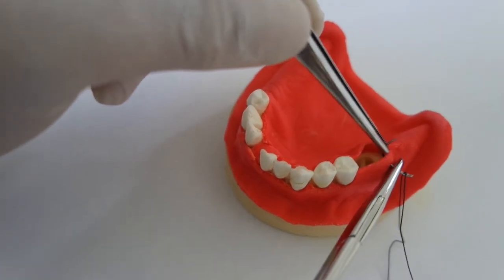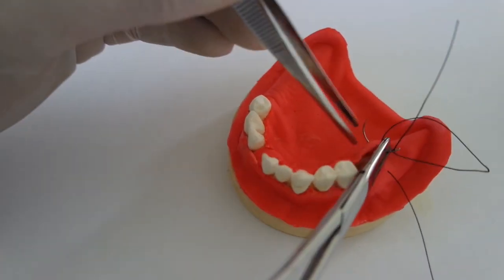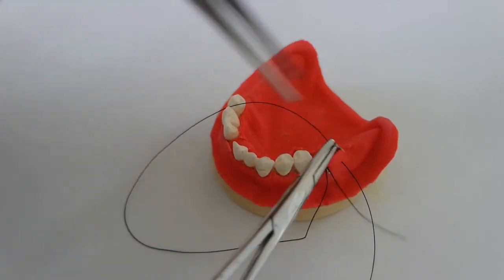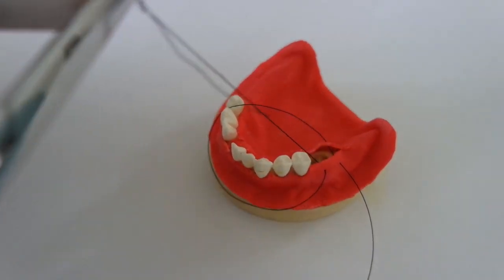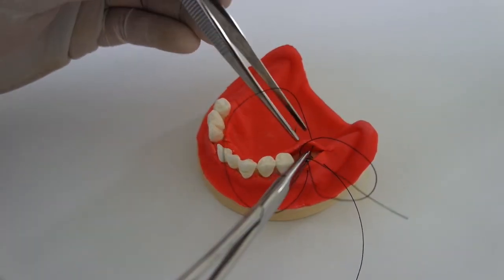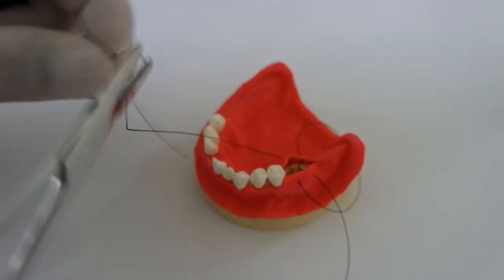Insert the needle through the first side of the tissue, then the opposite side from the bottom to the top surface. Advance just a little bit further along the tissue. Insert the first side from top to under surface just across from the suture on the other side and come out on the under surface of the tissue. Now enter the under surface of the other side even with the first suture and come out on top. The suture can now be tied.